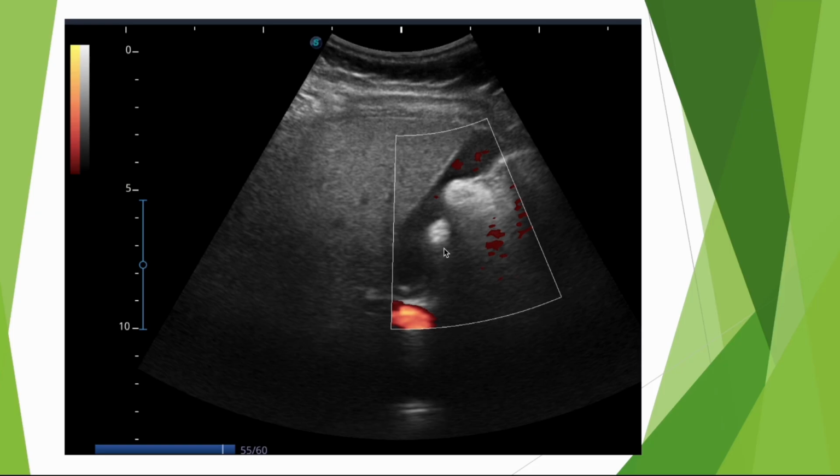So we get two images. Two highly echogenic images, two rounded images, apparently present in the gallbladder, and it is a calculus. It would be very, very easy, if you were a beginner and not trained in analyzing artifacts and understanding ultrasound images, to conclude with the diagnosis of gallstones.